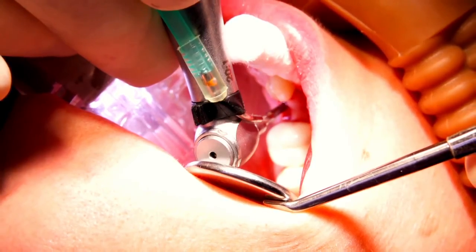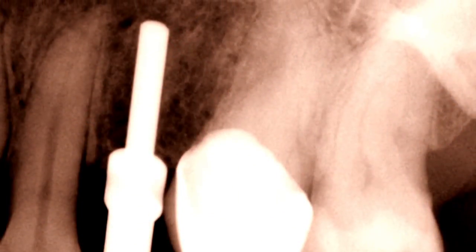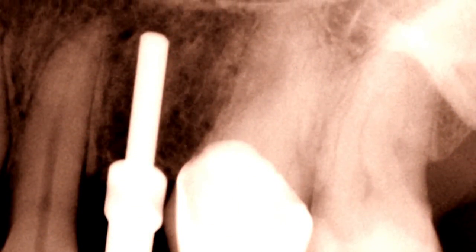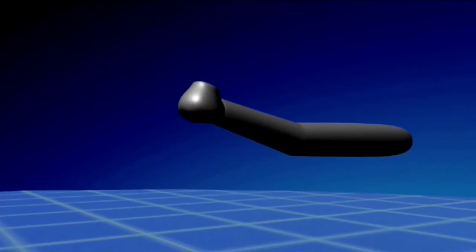Popular protocol is to do a pilot drill penetration with the chosen drill stop. Take an orientation film and make the drill stop adjustments for the ideal length of osteotomy. Request that your assistant place the chosen color on all progressive drills and quickly complete the preparation without having to visualize the drill markings in the mouth.